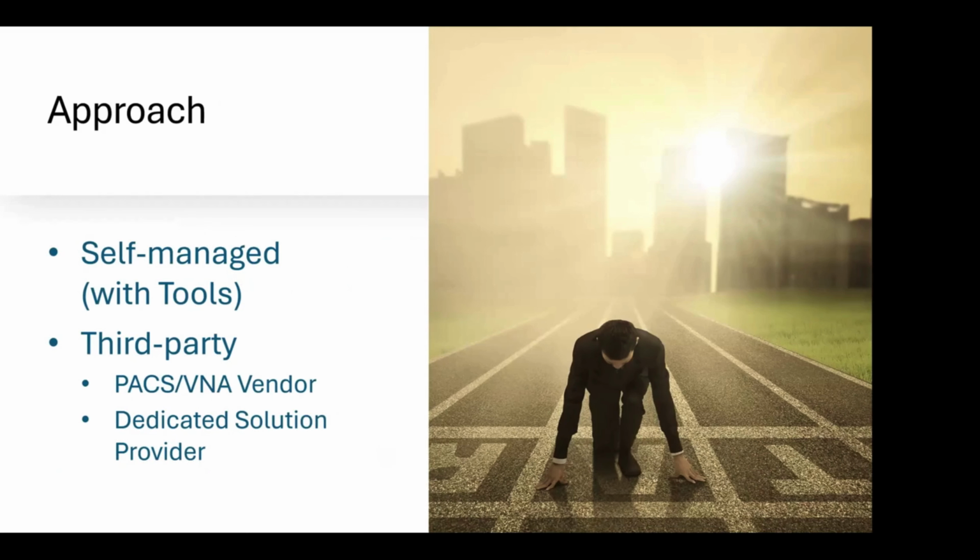The next step is typically understanding the approach. So are you going to be self-managed with tools? For example, if the new system you want to migrate to has data migration tools which your staff is trained on, are they going to manage that themselves? Are they going to license some tools and do it themselves? Or are you going to outsource this, which is typically more common, but that may be outsourced to the destination system vendor, like the PACS or VNA vendor, who may themselves subcontract it to a specialist who just does data migration, or you may contract with a dedicated solution provider who does these types of data migrations.